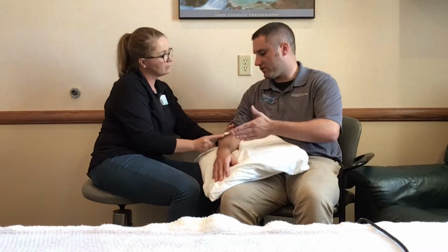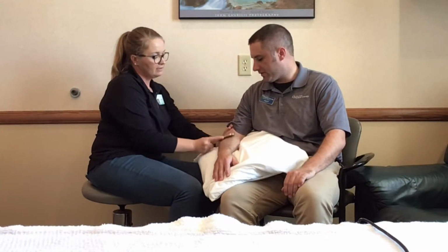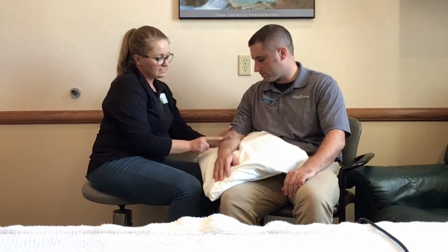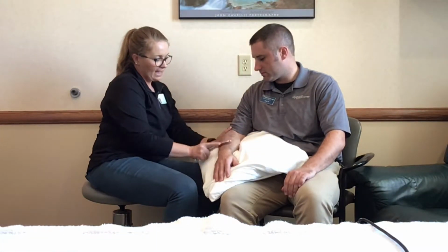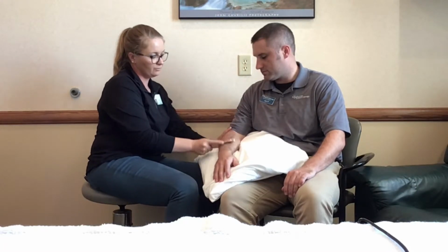So you can actually tell from when you start to when you finish exactly the quality of the tissue and whether what you're doing has been effective. And I'm sure if anyone knows what I'm talking about, if you feel your forearm or your leg and you feel that tight band of tissue, that's what I'm trying to work out. Yep. And you can see Josh is getting a little red here, but it's not bad. And it's not uncomfortable, I don't think. Nope. It's just nice and smooth.